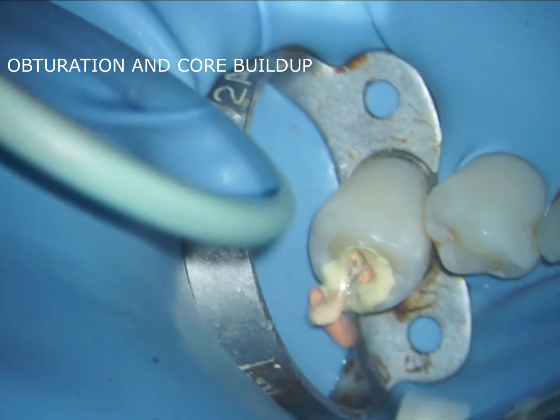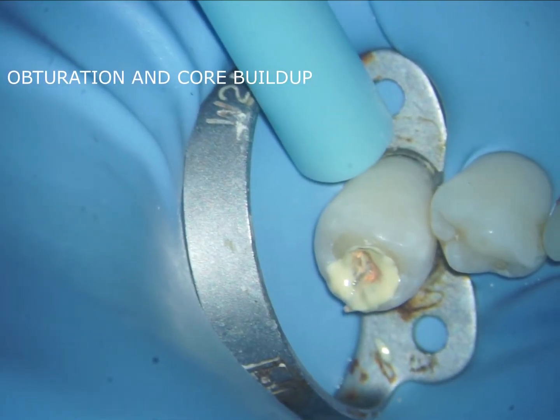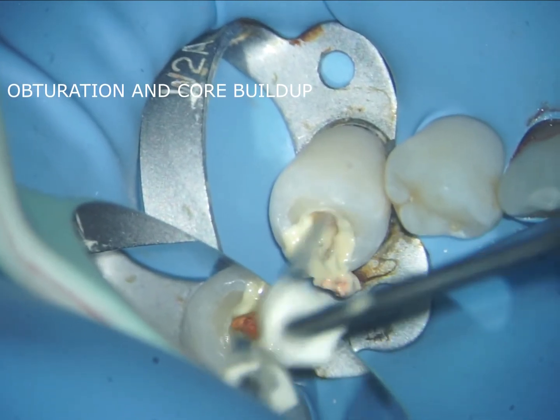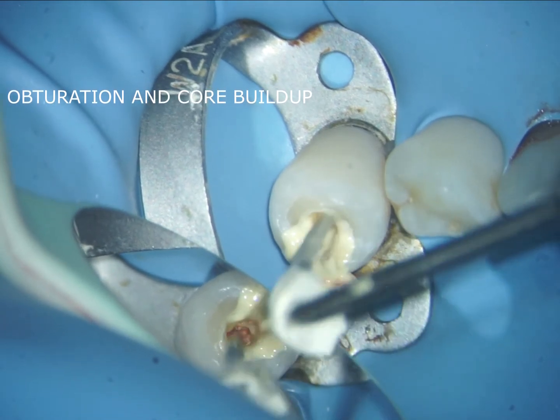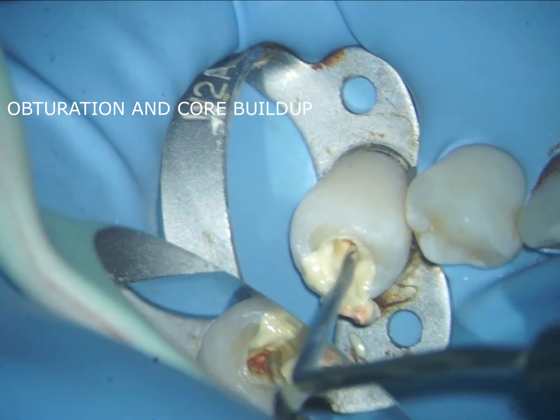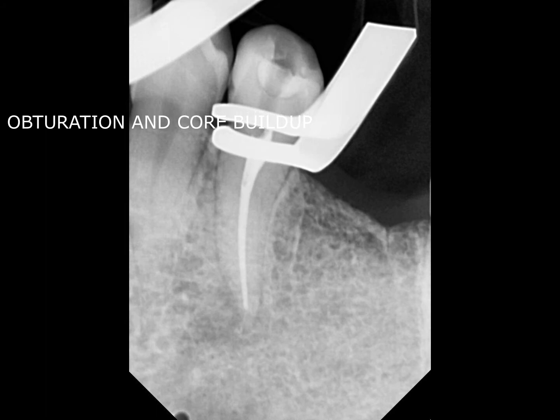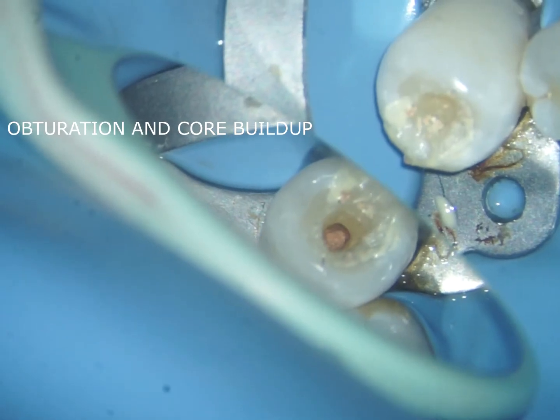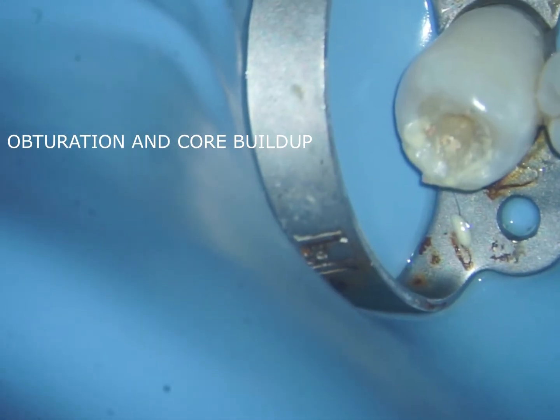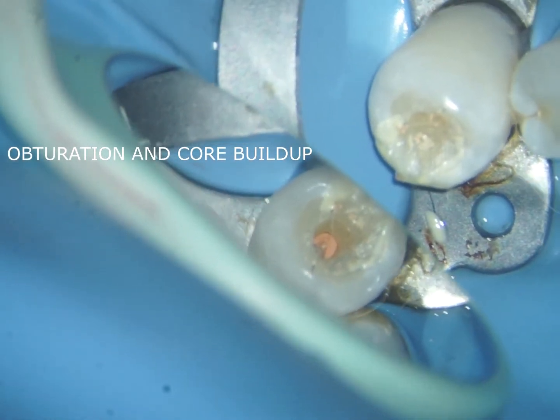We'll use a touch-and-heat device to shear off the cone from the coronal portion, then down-pack it, and use a backfill unit to fill up the rest of the canal. Here we're using the touch-and-heat device again, slowly condensing and pushing the gutta percha to the apical thirds of the canal, creating space so that during down-pack it flows into the lateral accessory canals and three-dimensionally fills the apical thirds. This is the obturation x-ray after the down-pack and backfill. We'll now use our backfill unit — Fast Pack by Oritam — to condense the coronal thirds.